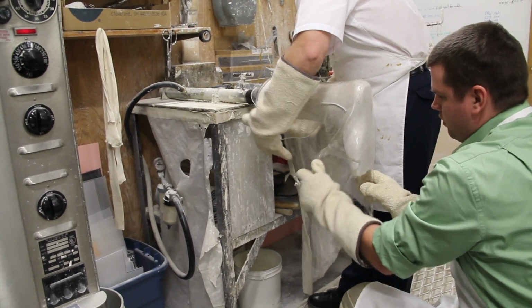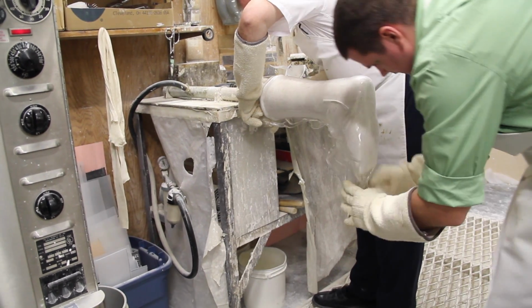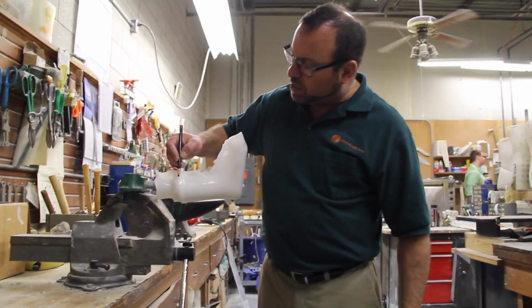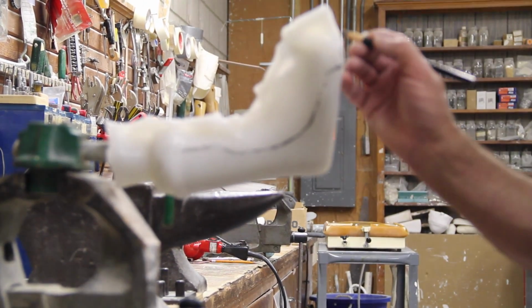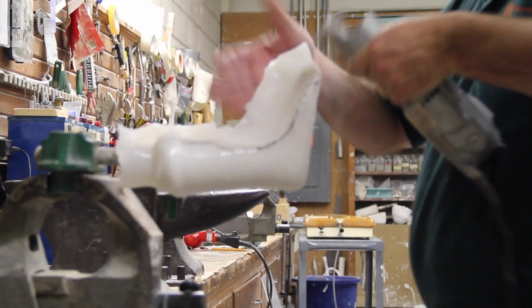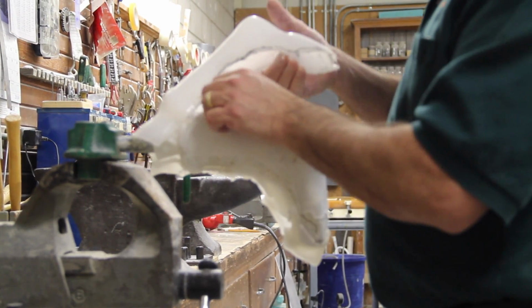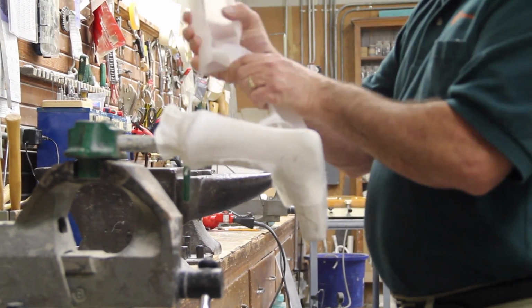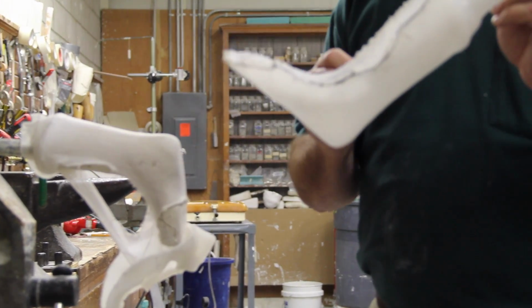The next step in fabrication is vacuum forming the plastic around the AFO. Once we seal up the plastic around the cast, it'll shape to that cast. The next step in the fabrication process is we'll draw our trim lines, and then we'll cut this out with the cast saw. And we'll peel the plastic off the cast. And then from this stage is where we'll start grinding out the edges and finishing up the product.